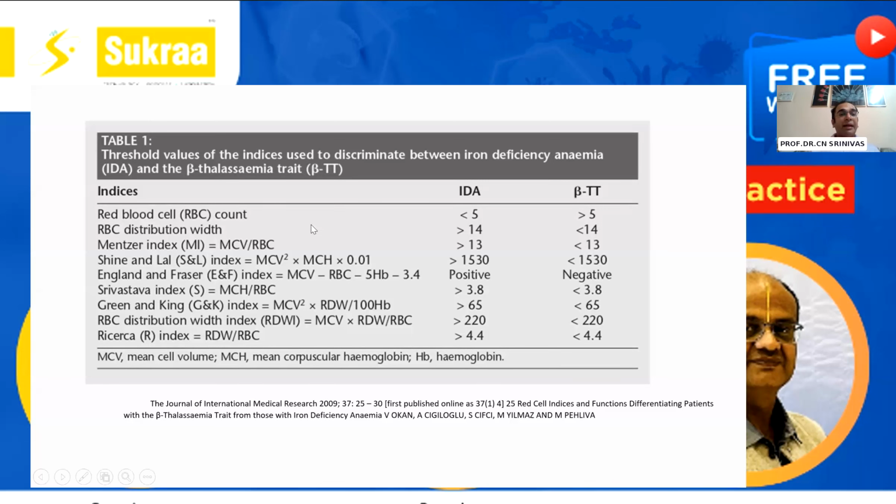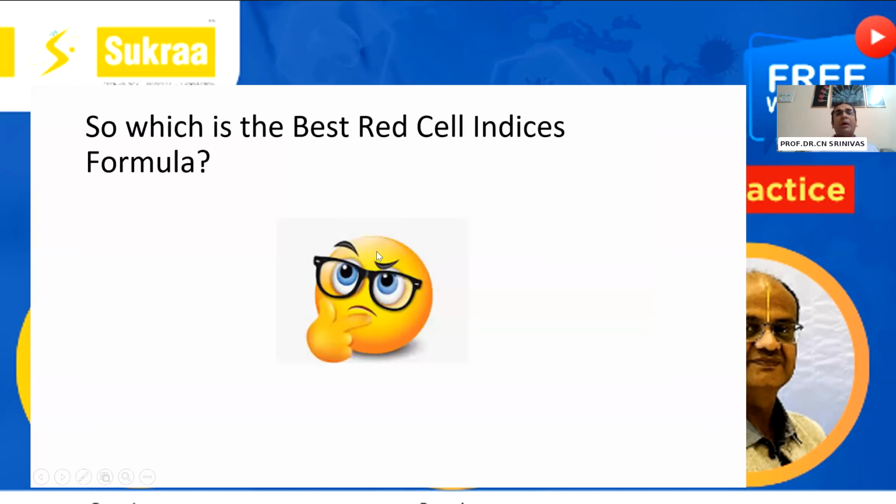Next, we have the Mentzer index, which has a cutoff value of greater than 13 for IDA, less than 13 for beta thalassemia trait, right? And we have the RBC distribution width, again greater than 14, less than 14, again sensitive for the differentiation. Then there are other indices as well. So one gets confused, which is the best index to follow. You get confused. What do you do? So we are all confused.